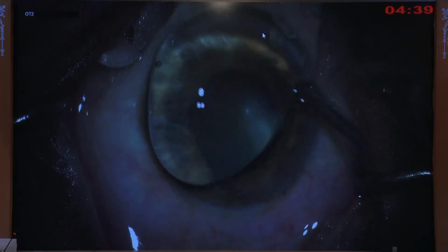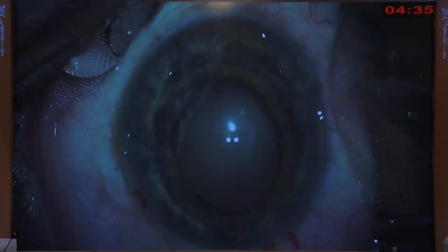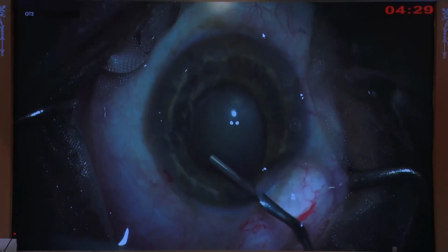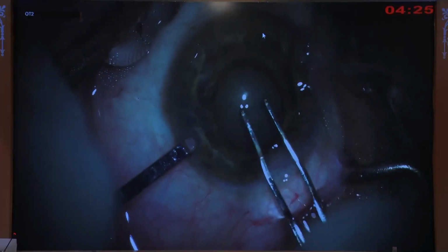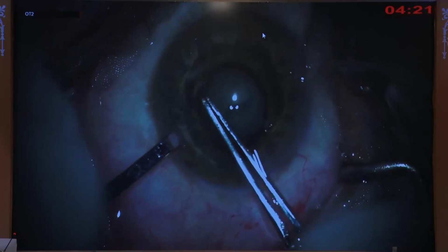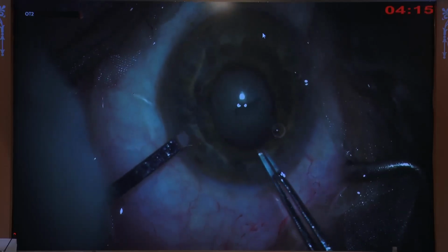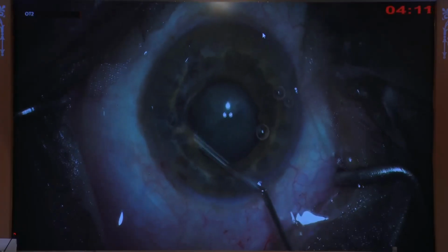So we dilate the pupil properly, and then put dispersive visco. After that put the high molecular weight viscoelastic, for more dilatation of the pupil, and also behind the iris to push the iris properly. After that you make a rhexis just behind the iris. You can go very gently, and make a slightly larger rhexis, because the chances of phimosis are very high.